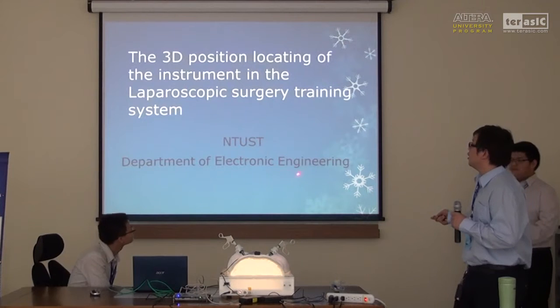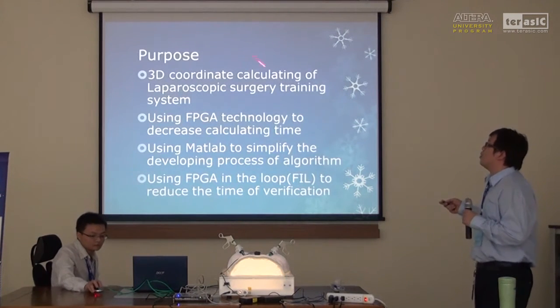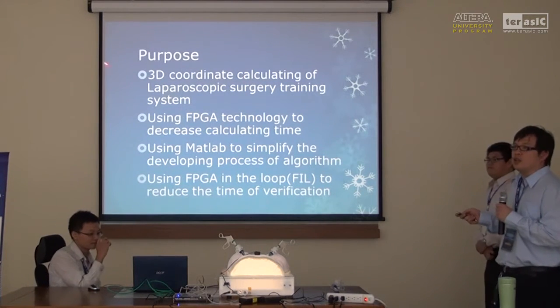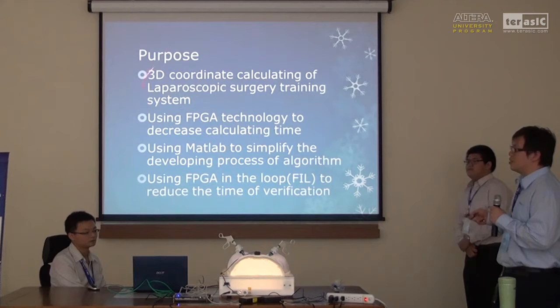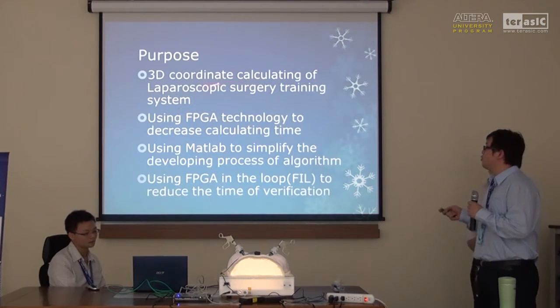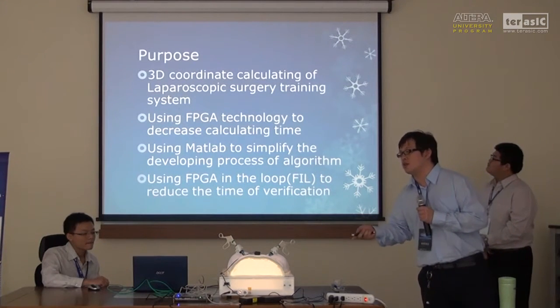This is our topic. Then, this is our proposal. The 3D coordinate calculating in the Laparoscopic training system is our goal. And using the FPGA to improve our system is how we implement this system.